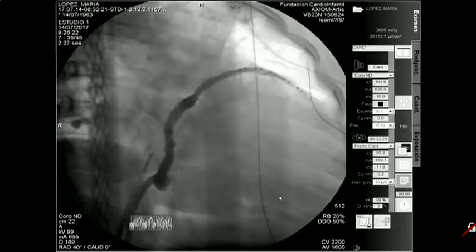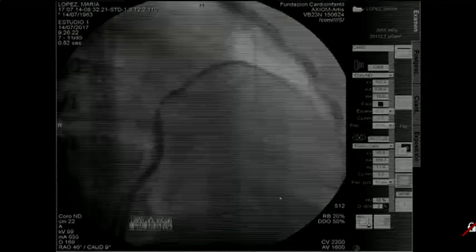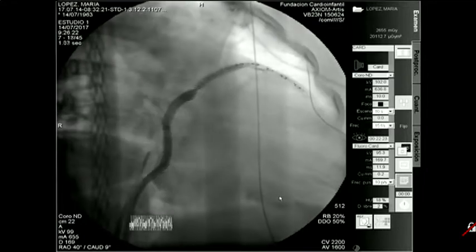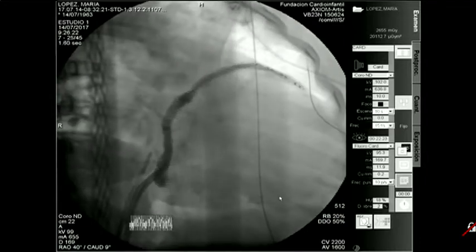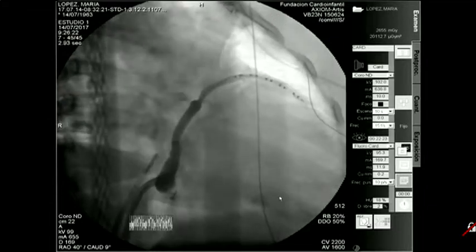This is the reason why with Dr. Fermin and our group, we described the technique of using guides to do unipolar pacing guides. But he's complemented that with the use of this catheter, which, as he said, is 3 French. What's the brand name of the catheter?